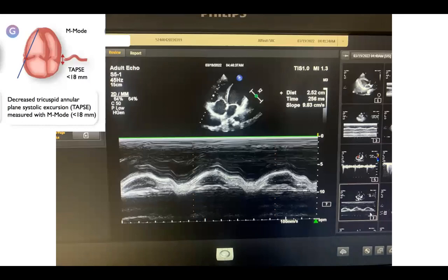In the same view, we can take the TAPSE and also the S-wave velocity. In this case, I measured only the TAPSE, which was 25 mm — remember this number as we will use it shortly. It is normal; there is no impairment of the TAPSE.